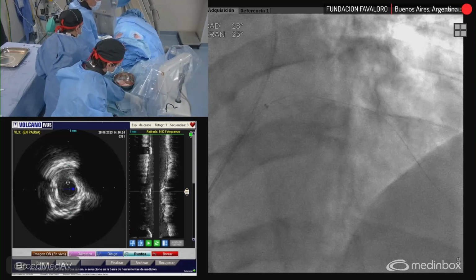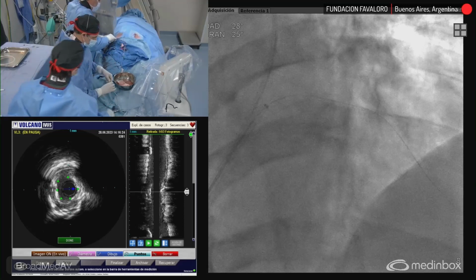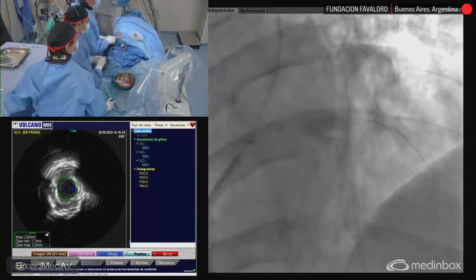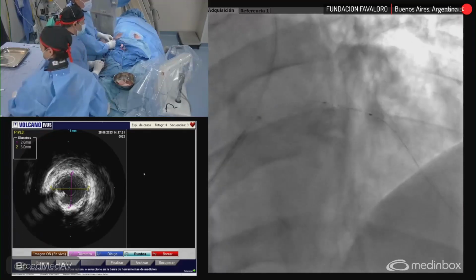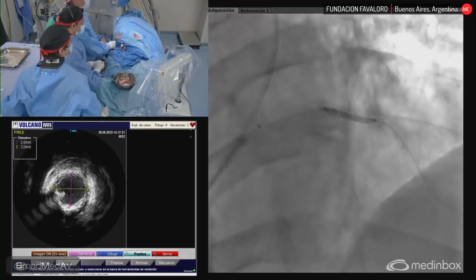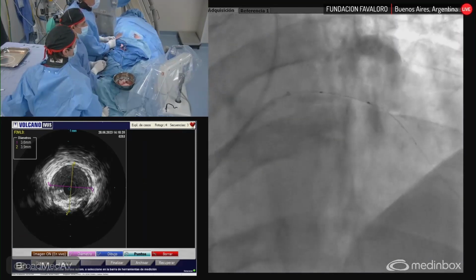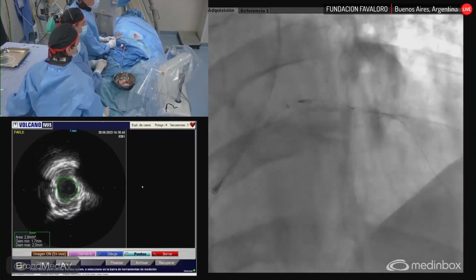So I'm gonna go distally. Then I'm gonna use, if I have, a 3.0 cutting balloon for the proximal calcified lesion, and then I'm gonna deploy the stent with the help of the telescope device. Find a cutting 3.0. What is the diameter? So the distal segment is 2.8. The middle segment is 3.7, and the minimal lumen area is 2.8.